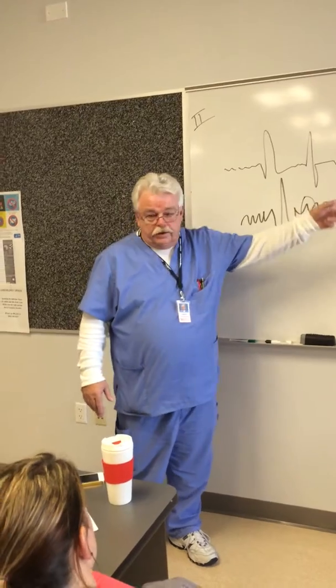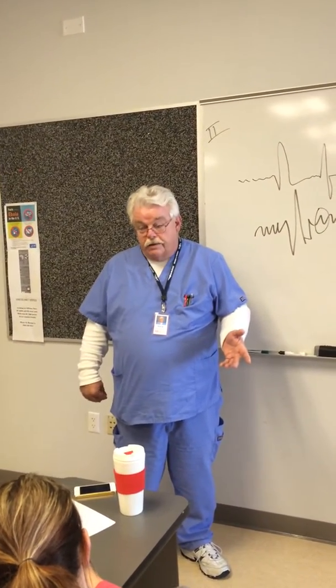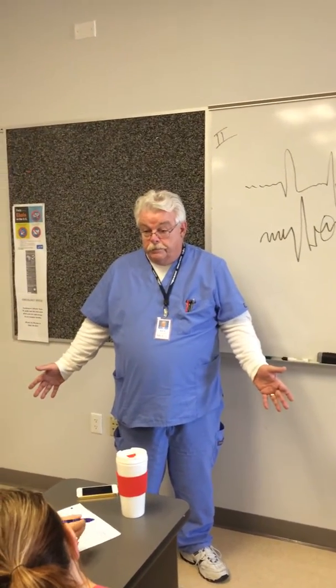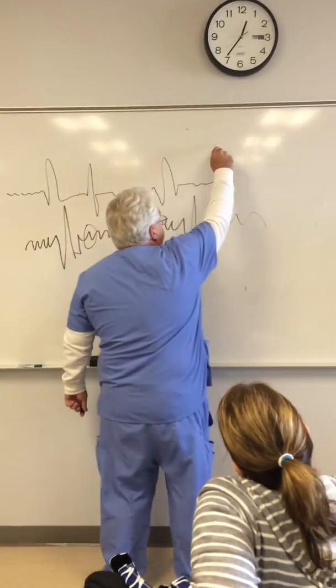So if you see these saw teeth, that's A flutter. Is AFib always irregular? Always, by definition. Irregular, no P wave, it can only be AFib. There's a fancy term if it's AFib greater than 100.